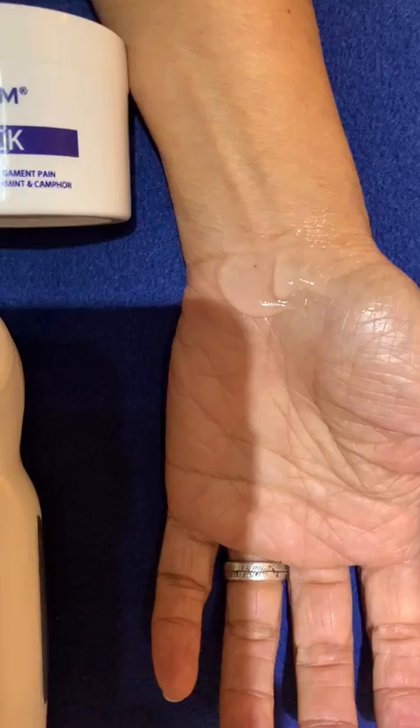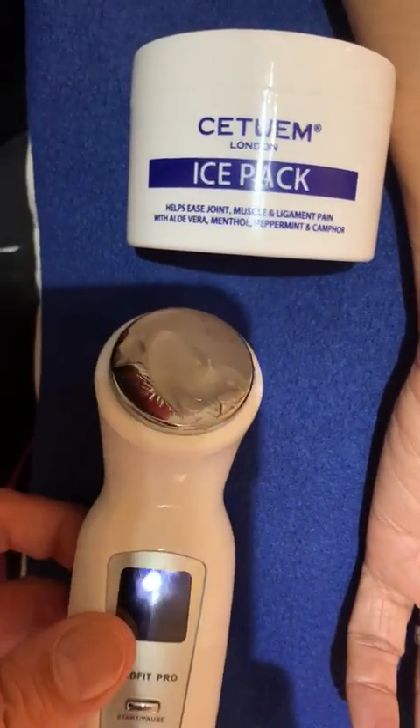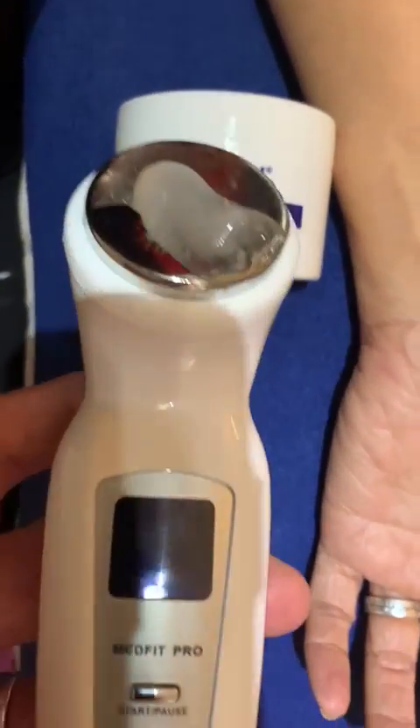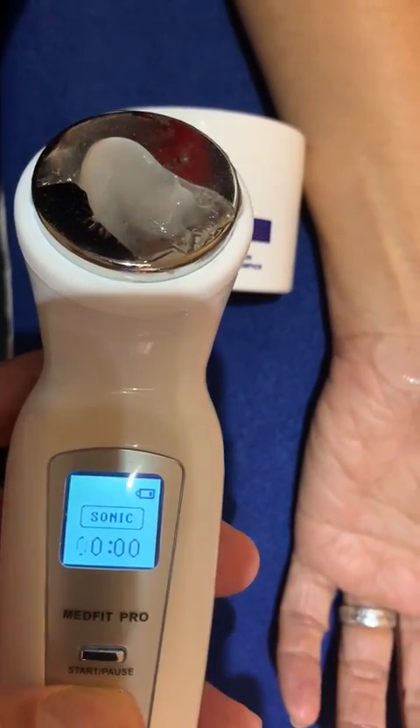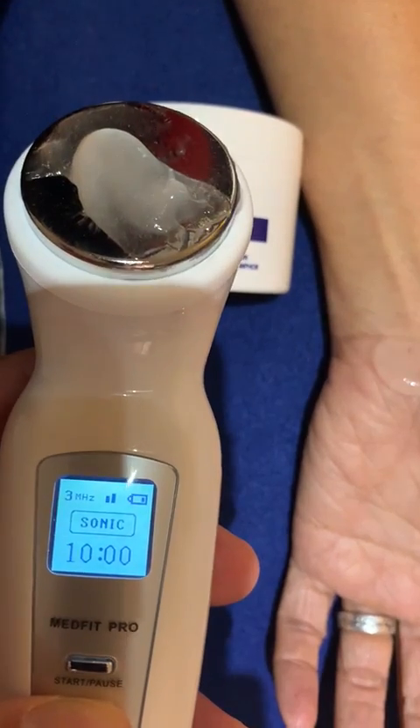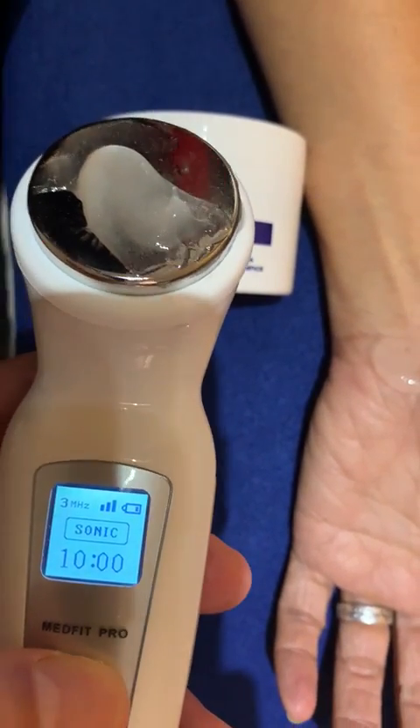Gel is placed on the affected area and also on the end of the probe. Switch the ultrasound machine on, the screen illuminates, set to level three, and click the on button.